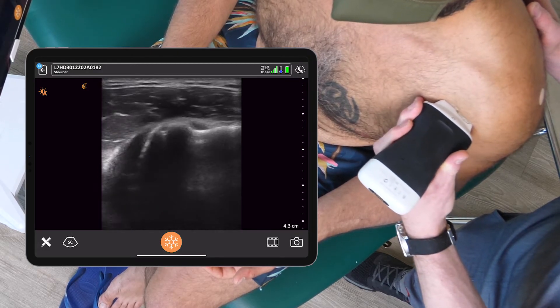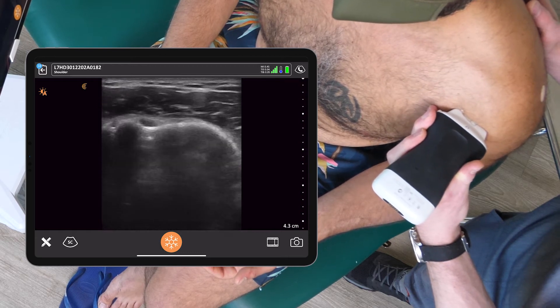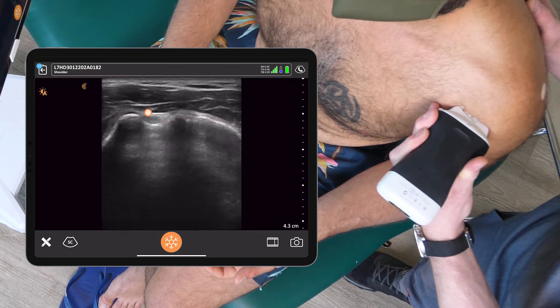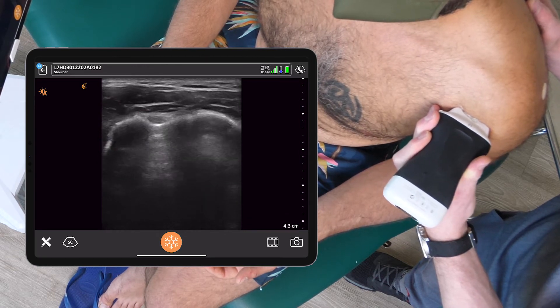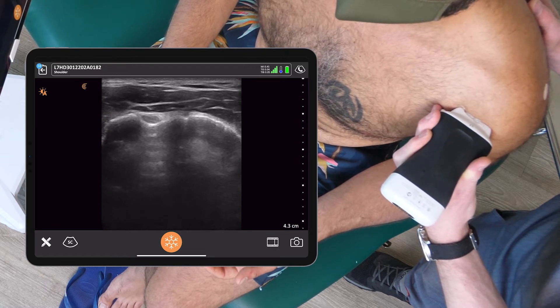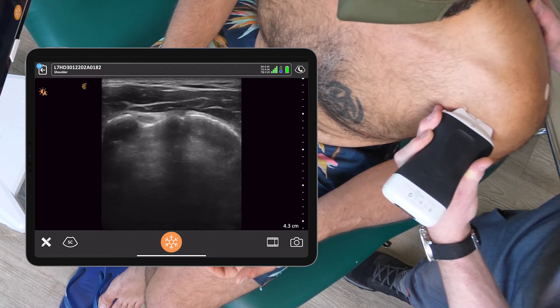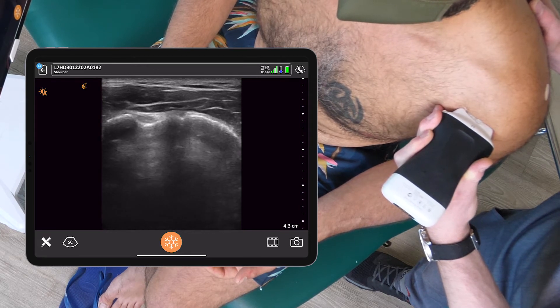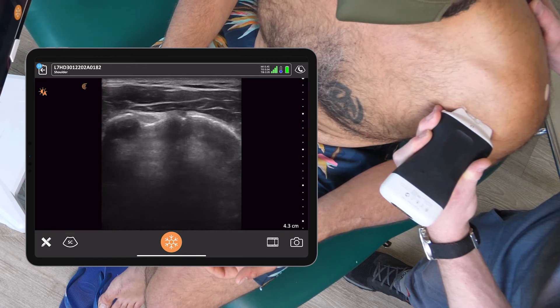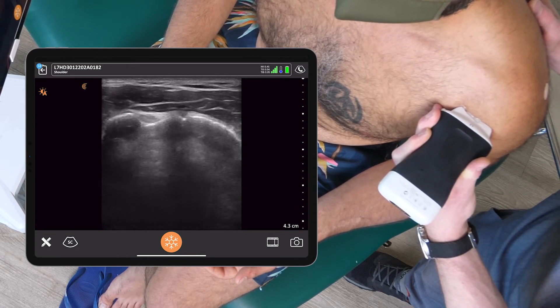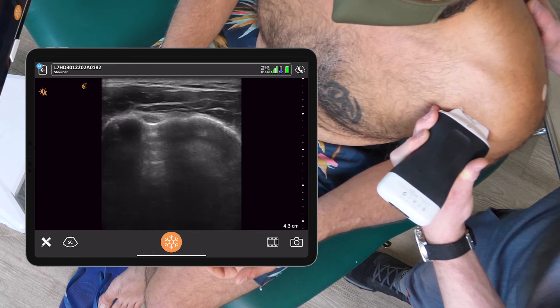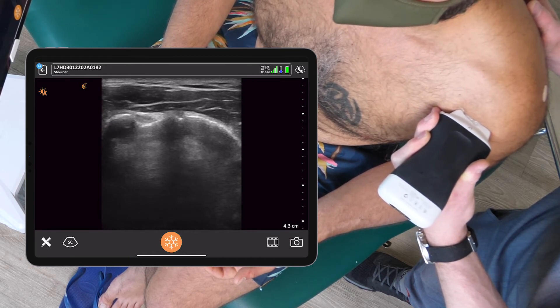We'll start with position one, finding and locating the biceps tendon in short axis. We can take a look and see the biceps underneath the sheath. There can be an effusion in this location when we're looking at the biceps tendon. At times, this effusion can come from the glenohumeral joint and cause a halo effect that is hypoechoic around this structure. It does not necessarily mean there is pathology of the biceps tendon or tendinosis.